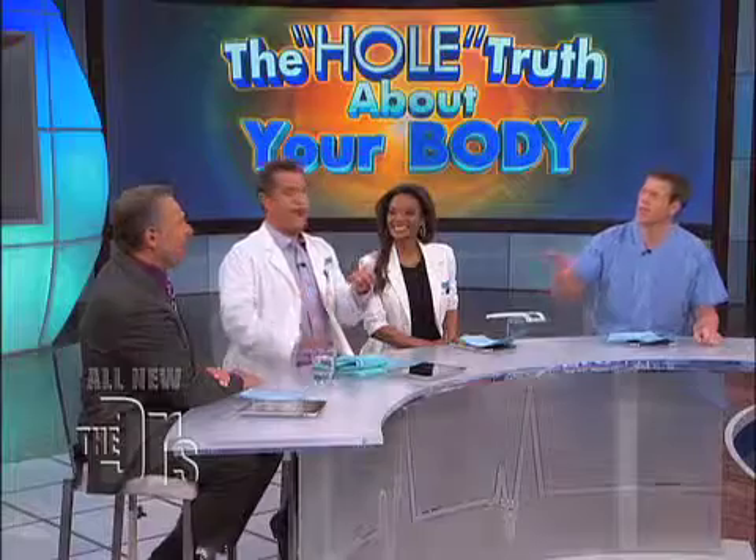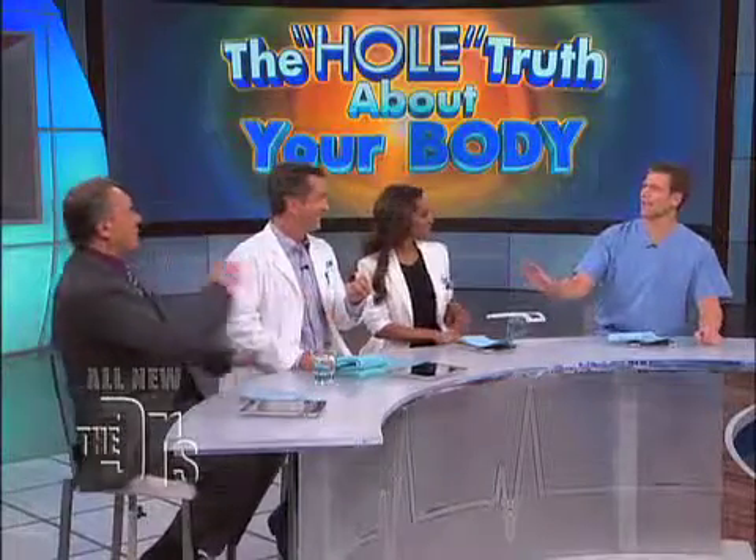I never thought I would say this to you, but Jim — show us your bowels, buddy. All right, here we go.